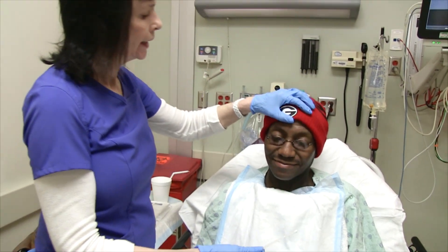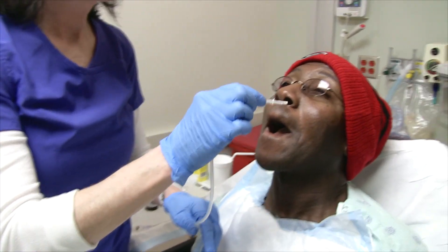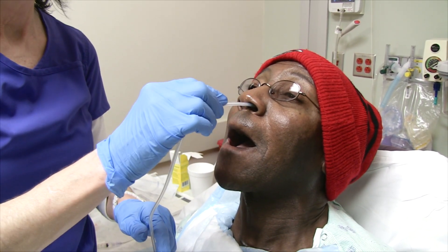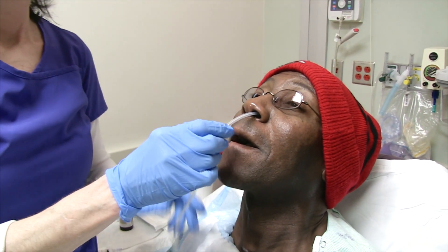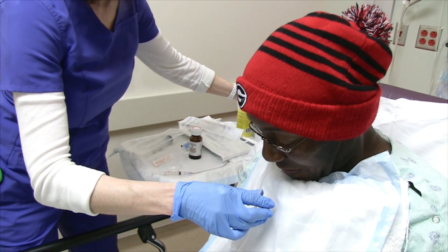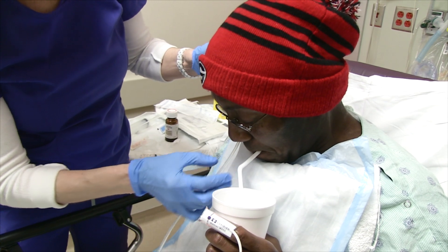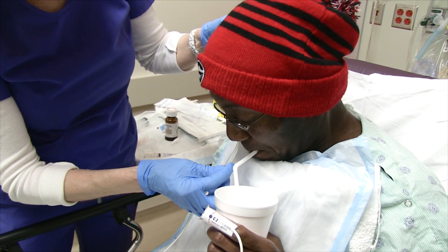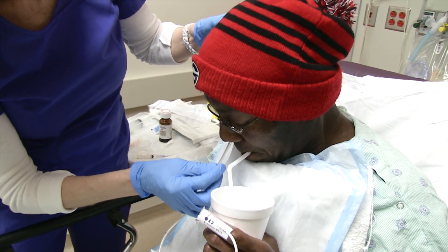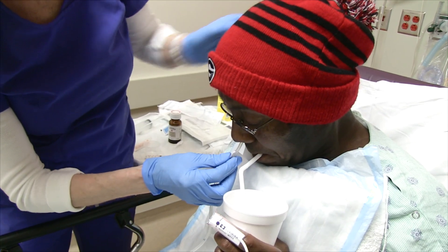So now I'm going to have him bend his head back first, and then we're going to aim down. Easy does it — have him take deep breaths. When we get to the right point, we're going to have him pull his head forward, then I'm going to give him the water and have him sip the water while I gently push in. And now we've reached our tape mark.